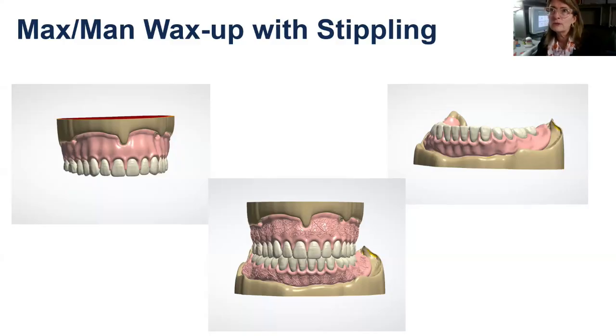That's a great opportunity to communicate with your patient and to observe with your patient if they have an existing denture. If they have an existing denture and it is smooth, I would probably recommend you prescribe a smooth denture from the lab, and note that in the RX notations. Oppositely, if their denture is festooned and stippled, then I would duplicate that with their new denture. If it's an immediate denture, I tend to lean towards stippling and festooning.